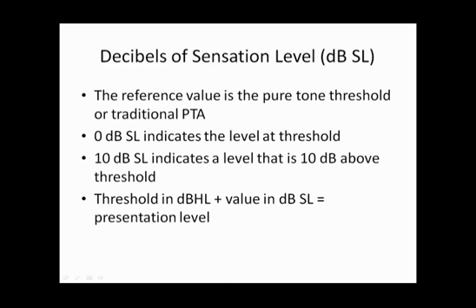Okay? So if you were at a clinic and you saw on the audiogram that the word recognition score was presented at 15 dB SL, re the SRT, and actually we haven't reviewed these speech tests yet, but just to give you a heads up, all that means is that 15 dB HL was added to some threshold. In this case, it was something called the speech reception threshold that we'll talk more about.